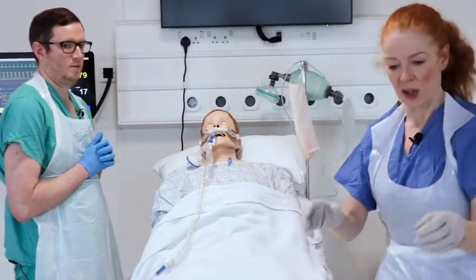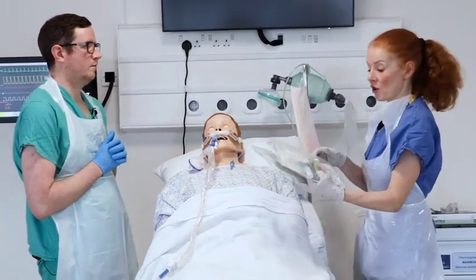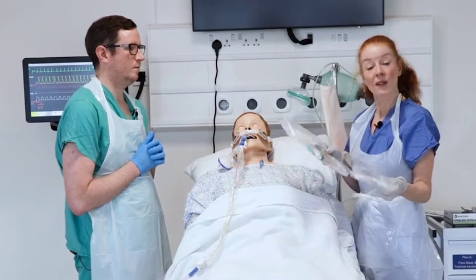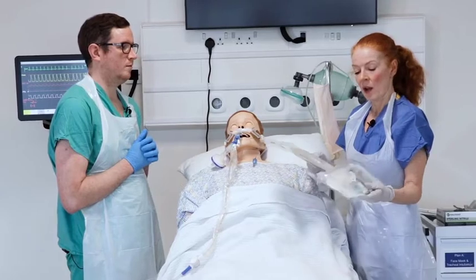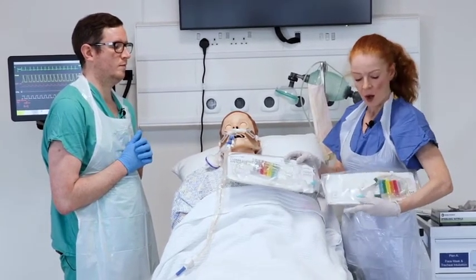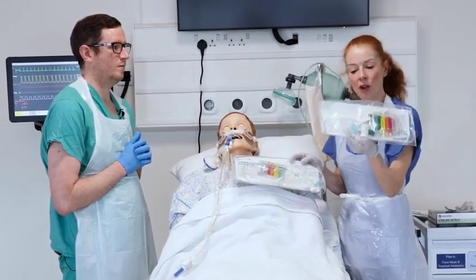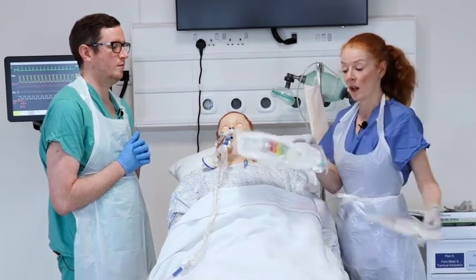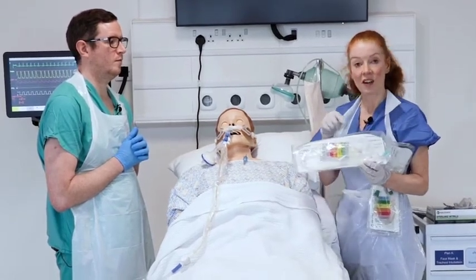In intensive care in NHS Lothian, we use closed suction, which protects staff from aerosol-generated particles. There are two forms of suction tubing: one is short and has an alert sign indicating it should only be used for patients with a tracheostomy. When suctioning down an endotracheal tube, that alert sign will be missing.